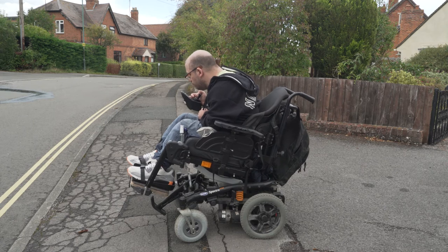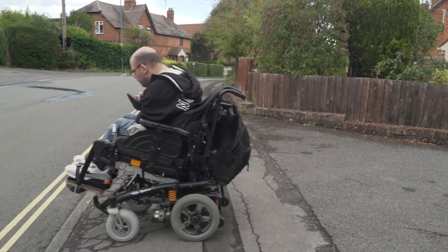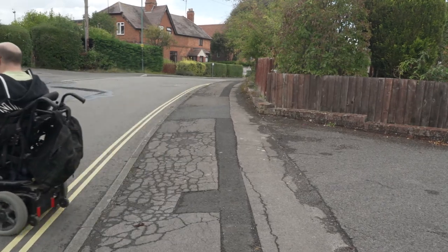To have more confidence in driving around, going up and going down drop curbs — depending on how steep they are and how confident you are — I would recline back to have a little bit more confidence.